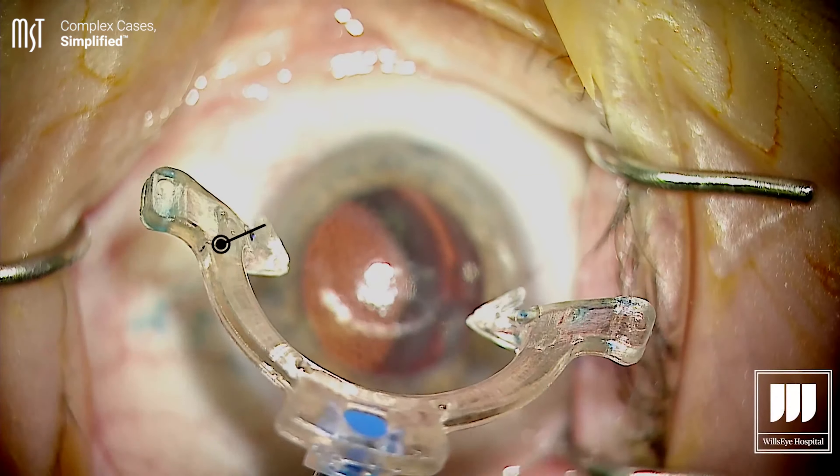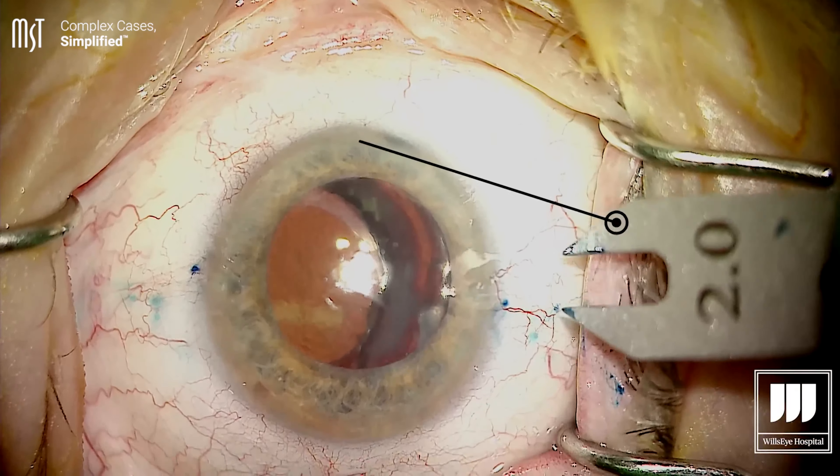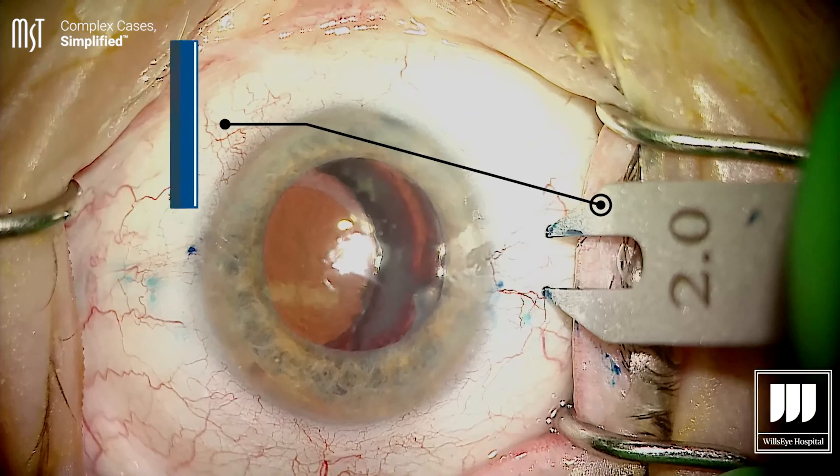In this peel pack, we've got almost everything you need for this technique. It includes a centration guide, an anterior chamber maintainer, low-temp cautery, a customized needle purposely built for this procedure, as well as a caliper set to 2.5 and 2 millimeters, which are some of the more common measurements you'll need. This peel pack being ready to go has really streamlined the surgery — all we need to do is use the centration guide to find the center of the visual axis, make our measurements, and use the custom-made needles combined with the AC maintainer to keep the eye pressurized.